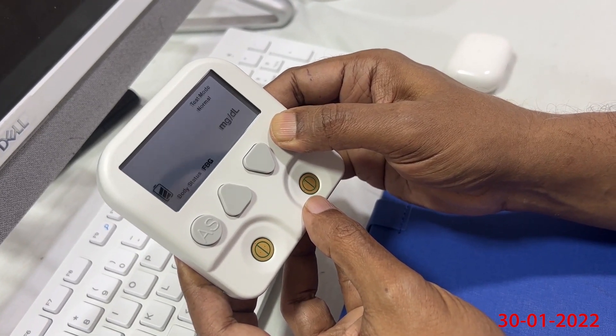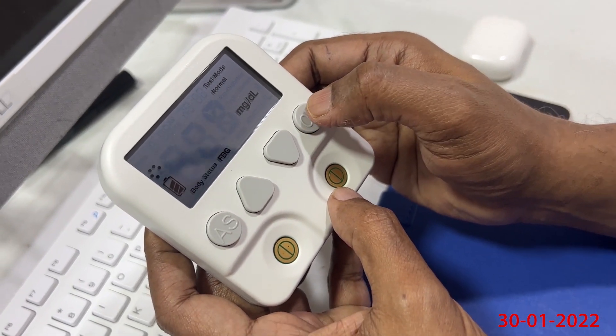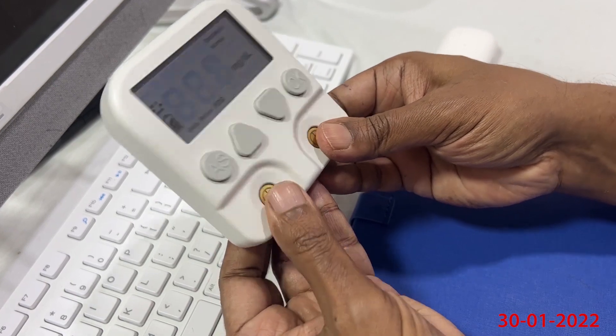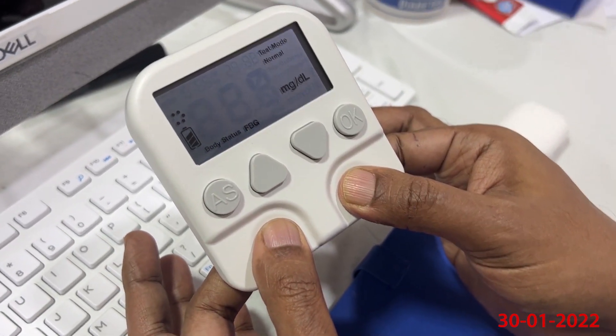I am switching on the device and then selecting the test mode. Since I don't have diabetes, I have selected normal mode. Then I am lightly placing my index fingers and my thumb over the sensors.